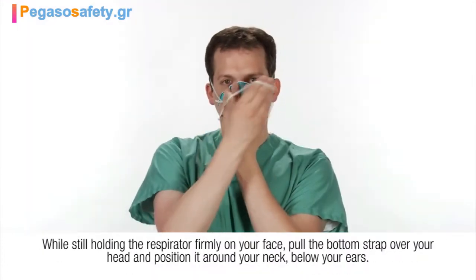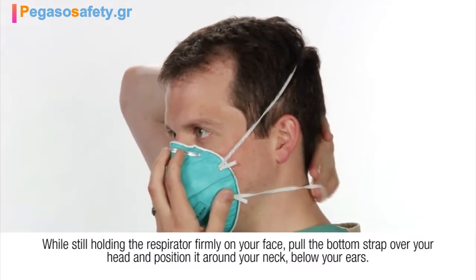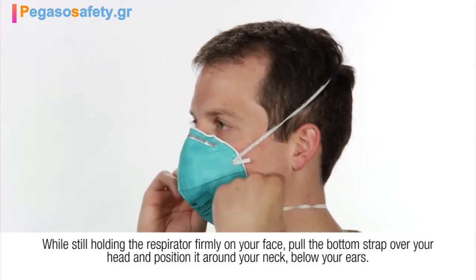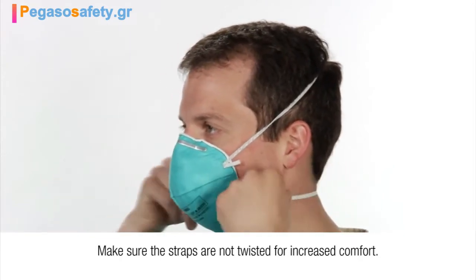While still holding the respirator firmly on your face, pull the bottom strap over your head and position it around your neck below your ears. Make sure the straps are not twisted for increased comfort.